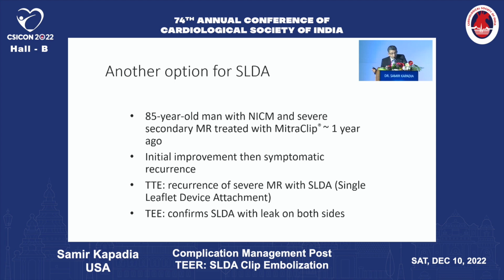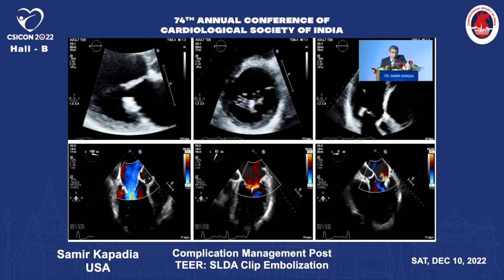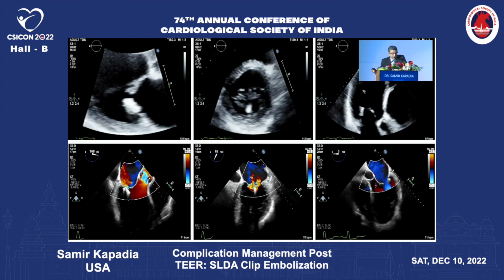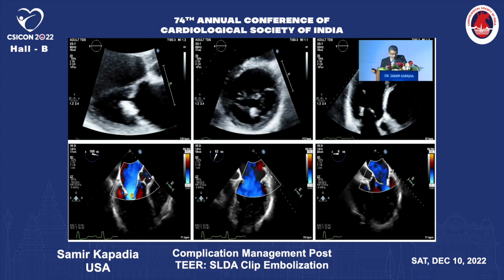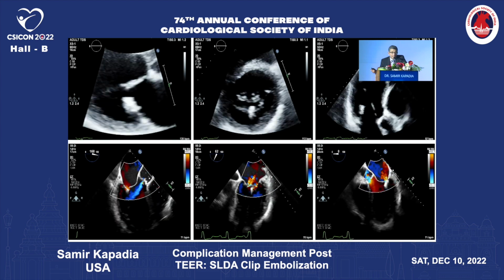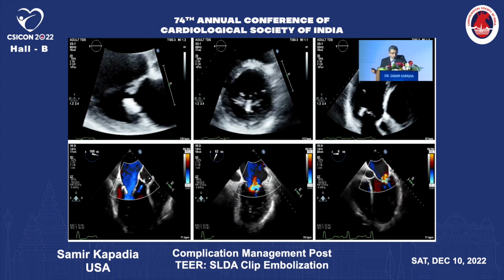This is another patient. Again, I want to say that these are all referrals, but some of this happens to you. So this is a patient that happened to us, that we put a clip and the clip got detached. Actually not the next day, but almost a month later. And the patient actually felt it. He was doing some heavy lifting, an 85-year-old guy, but he felt shortness of breath acutely. And here, it appears that the anterior leaflet is shorter than it started. So it looks like that it tore from the anterior leaflet.